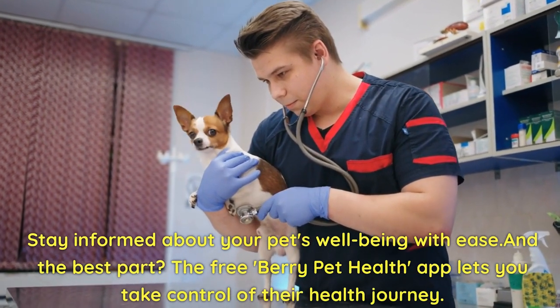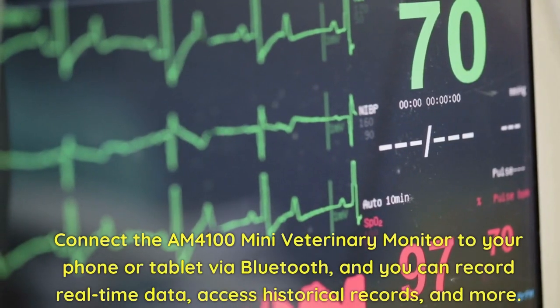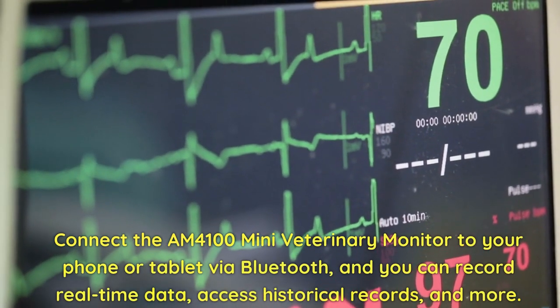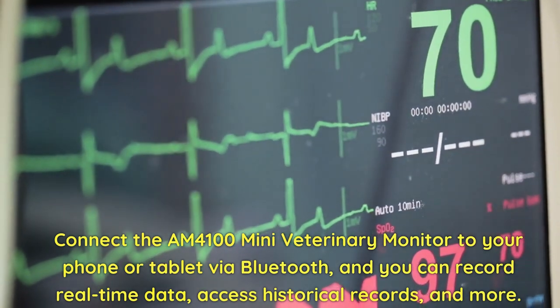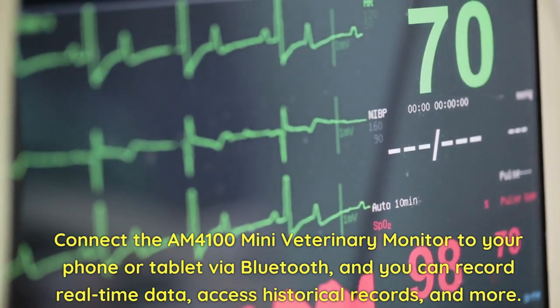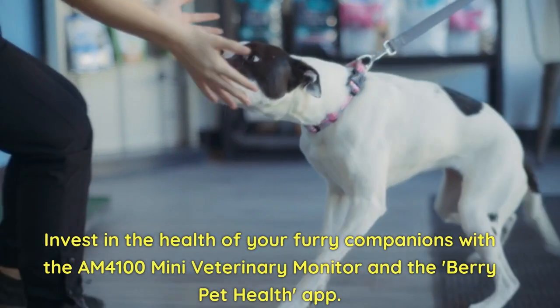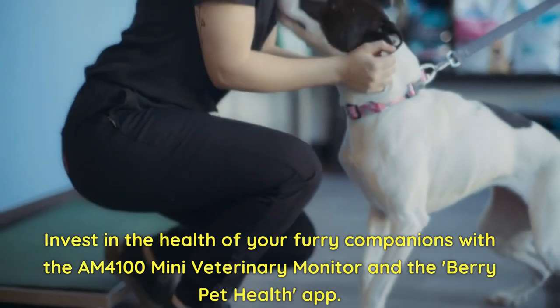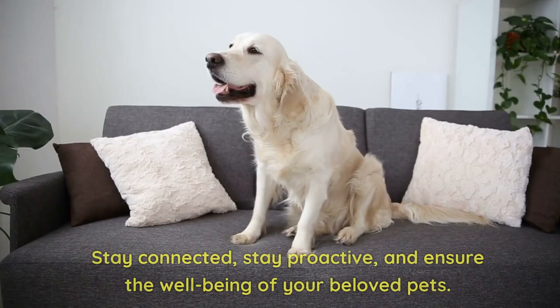The free Berry Pet Health app lets you take control of their health journey. Connect the AM4100 Mini Veterinary Monitor to your phone or tablet via Bluetooth, and you can record real-time data, access historical records, and more. Invest in the health of your furry companions with the AM4100 Mini Veterinary Monitor and the Berry Pet Health app.